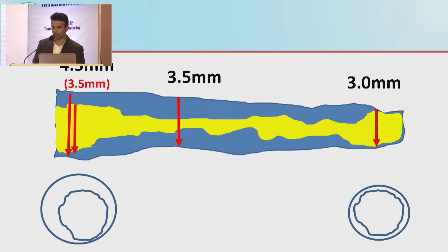So now you're stuck a little bit, where you're going to have to stent lumen to lumen, plaque to plaque at this landing zone. An alternative is that you extend your stent further back to a normal landing zone. So let's say that that was the ostium of the LAD. Do you want to nail the ostium of the LAD where there's a bunch of plaque? Probably not. This is your classical case where you would cross over and come back into the left main into a normal landing zone. Or if, let's say, that was the left main, this is the one where you stent right back to the ostium and you hang a strut back.